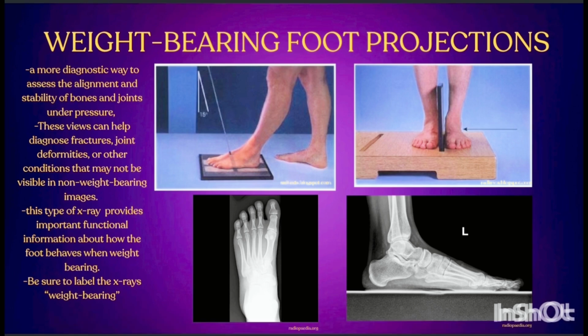So occasionally doctors' offices will order a weight-bearing foot x-ray or a bilateral standing feet x-ray. So what does this mean and why are we doing it? It's a more diagnostic way to assess the alignment and the stability of bones and joints when they're under pressure. These views can help diagnose fractures, joint deformities, or other conditions that may not be visible with a non-weight-bearing x-ray. This type of x-ray can provide important functional information about how the foot behaves when weight-bearing. Be sure that you label your x-rays as weight-bearing.